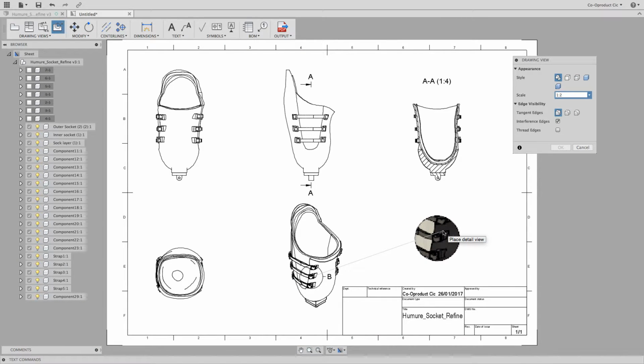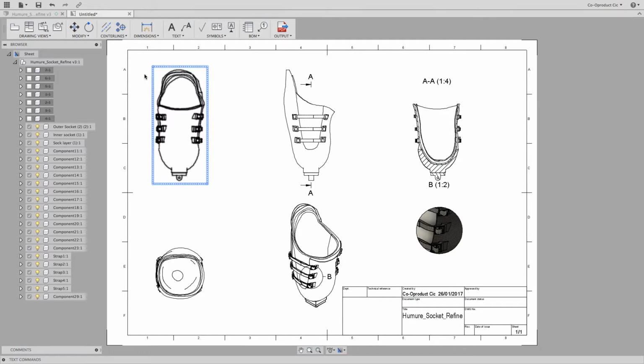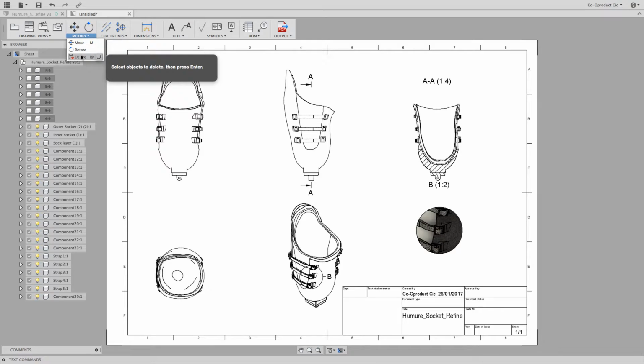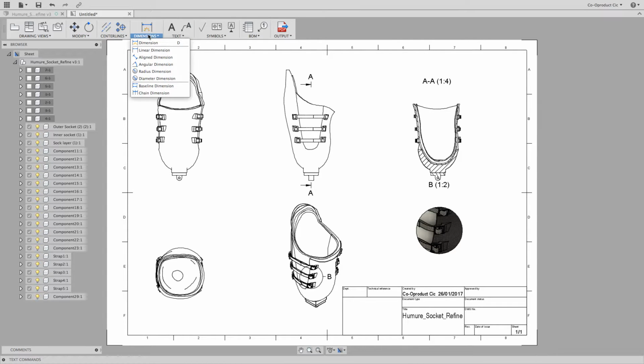But before I place it, in the dialog window, I want to select the style as shaded. And when I've done this, I'll click to place it here. Then I can click OK to close the dialog window. If I wish, I can go to the toolbar and click Modify to move, rotate, or to delete any of the views. I can also place center lines or center marks. And we can dimension parts of the drawings also.